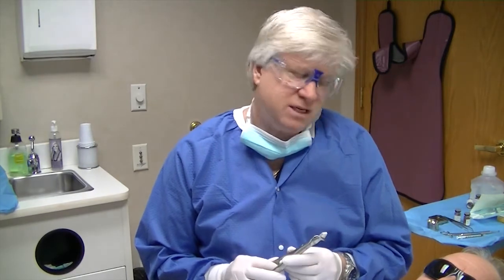It has a crown on it now, but there's some decay and a fracture. So our plan today is to remove the tooth atraumatically, maintaining the buccal plate, and then placing an implant immediately if possible. We'll also be grafting the posterior, or the distal root of the tooth.